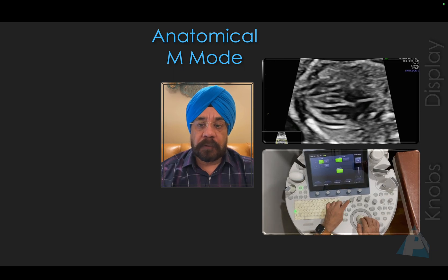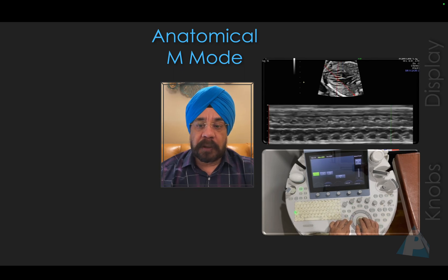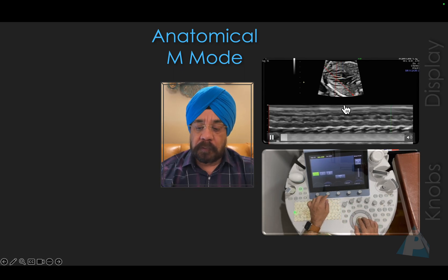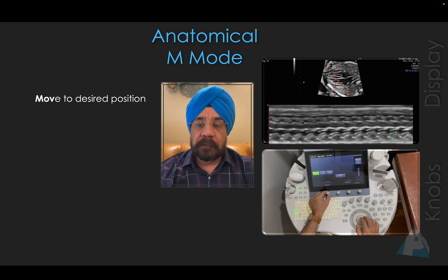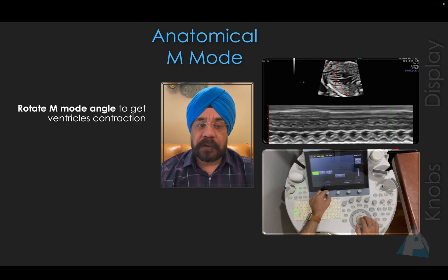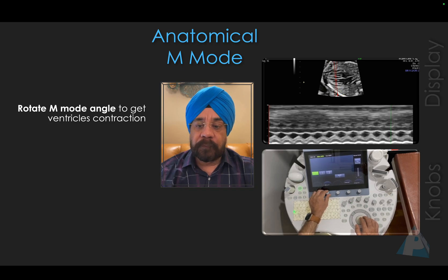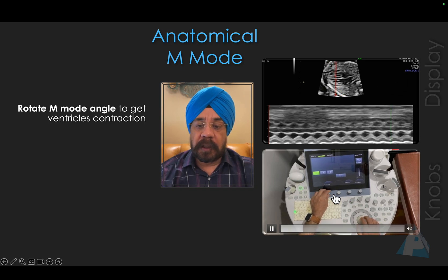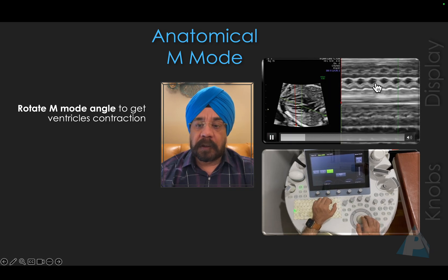Now once you have activated M-Mode, it appears on the screen. You then move it to the desired direction. Once moved to the desired direction, you rotate — you can see how I am rotating here — just to get a good ventricular contraction.